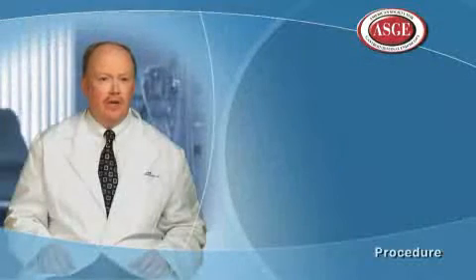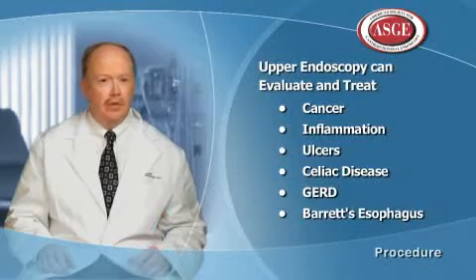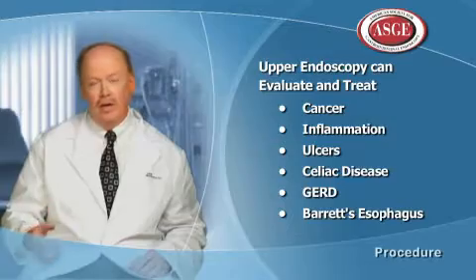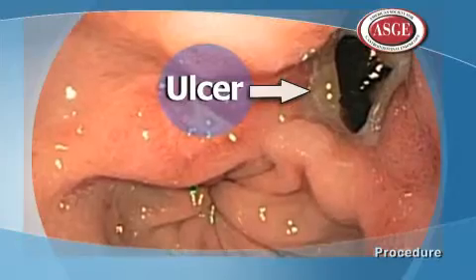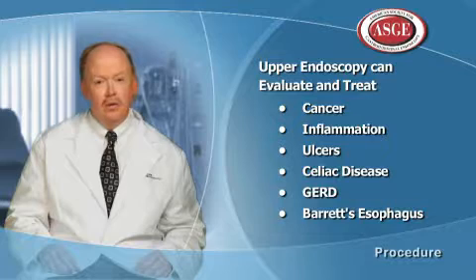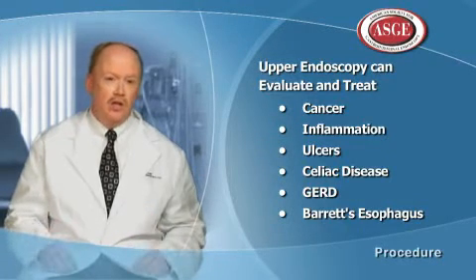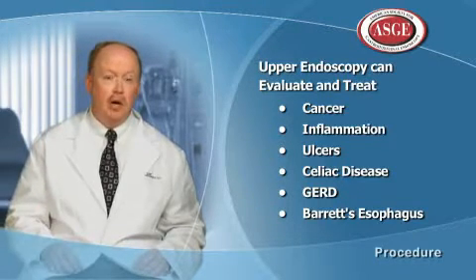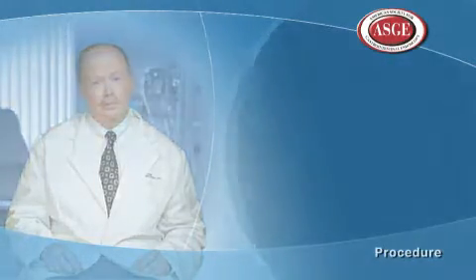Well, there's a number of things that you can find in the upper digestive tract. We're first and foremost looking for the reason that they had their symptoms. We find things like malignancies or cancers. We can find inflammation in the lining of the stomach. We can find and treat ulcers. People who have food intolerances such as celiac sprue, we can look for that and take biopsies to that end. We look for changes in the esophagus from reflux. We look for premalignant or precancerous conditions such as Barrett's esophagus. So there's a wide variety of things that we can accomplish.